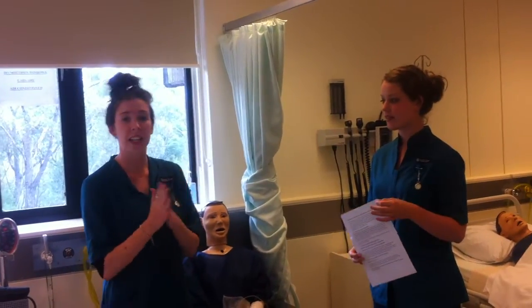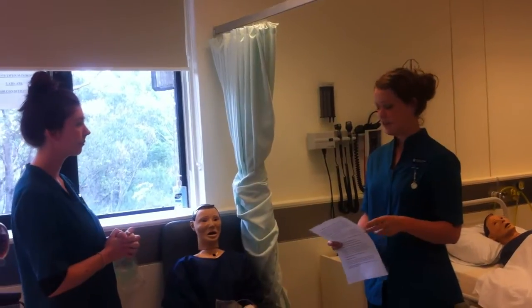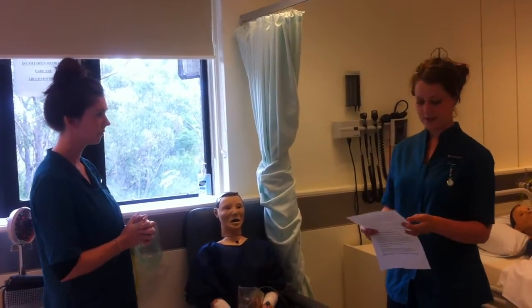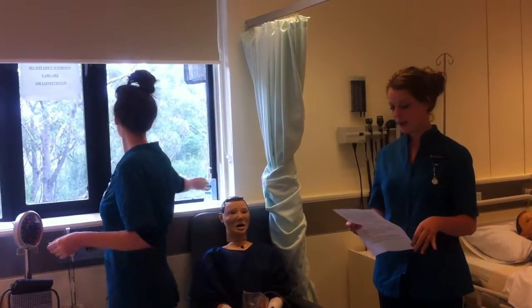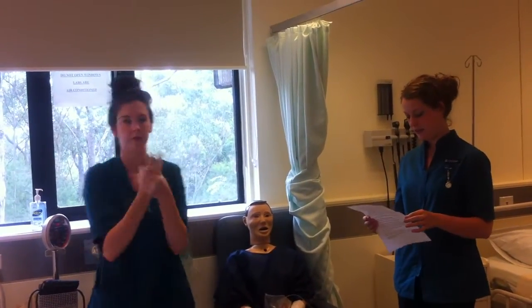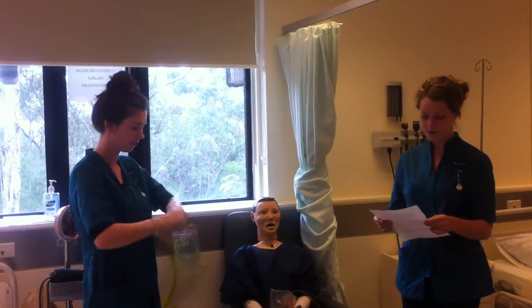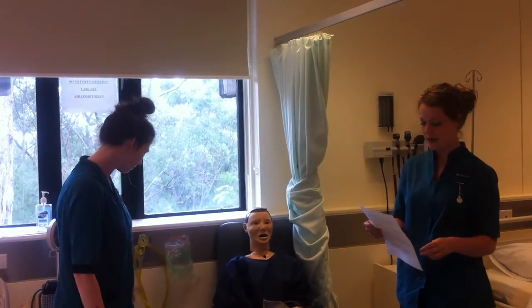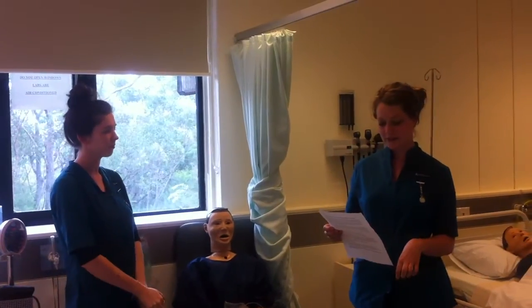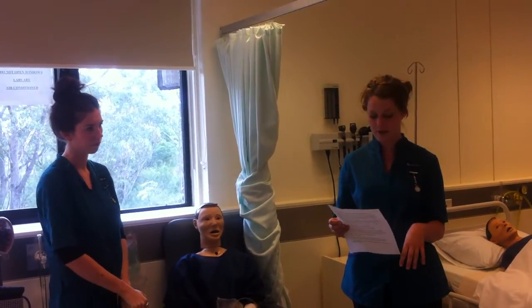So the third therapy we're going to give today is oxygen therapy for Mr. Saunders. Penny will perform hand hygiene to prevent cross-contamination, and then we'll use therapeutic interaction with the patient. This involves calm, gentle, confident and relaxed movements and tone of voice, and talking to the patient, using closed questions to assist the patient to relax and become more cooperative.